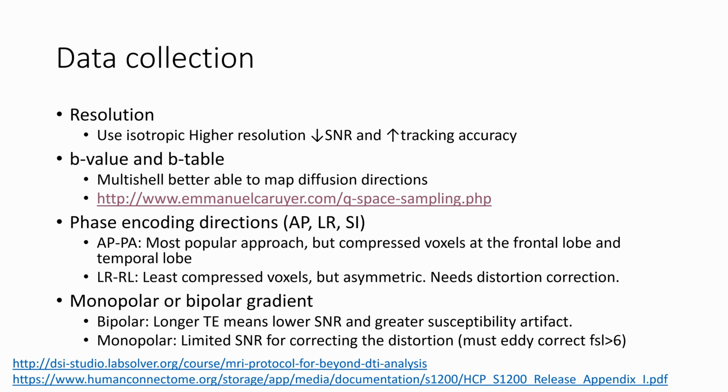Wait, you mean like physically shaky? Yeah. When you're collecting the data? Yeah. Okay. Yeah, it's kind of interesting to be in there when you bump up the B values and it's starting to rock.